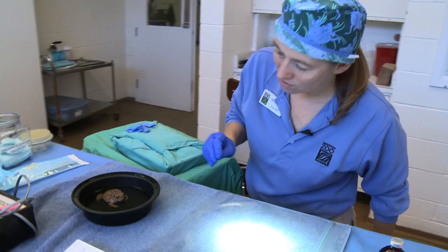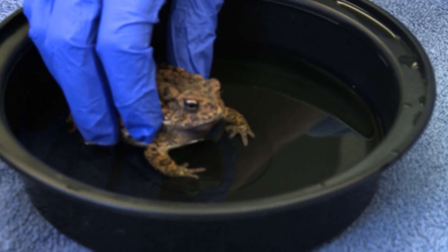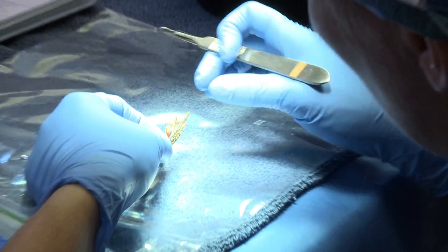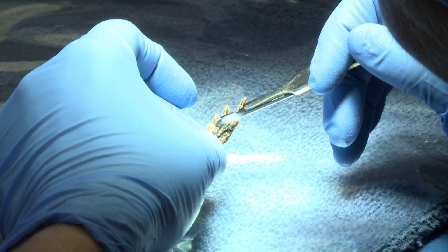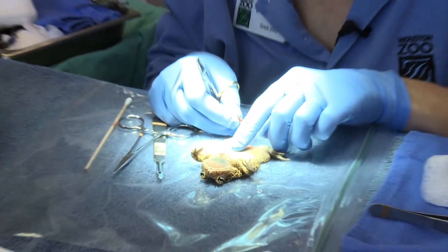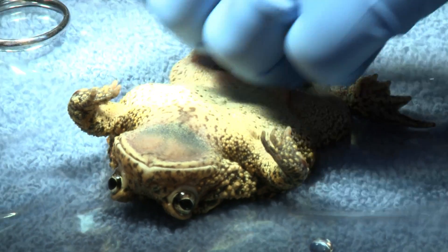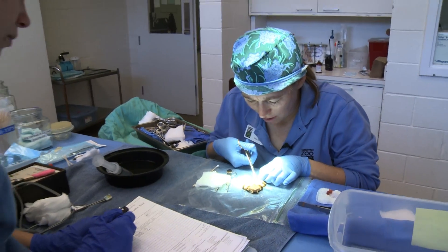Right now he's definitely lower down in the water than when we started and not moving his chin as much — still a little, but definitely slower. It looks like he's at the depth we want, so we're ready to get started. This is where the mass was that I took off originally, so we're going to take a bigger margin now, which I think means taking at least these two toes off. You can actually see his heart beating right here. Eva will put the specimen in formalin and submit it to the lab to see if we got good margins or not.